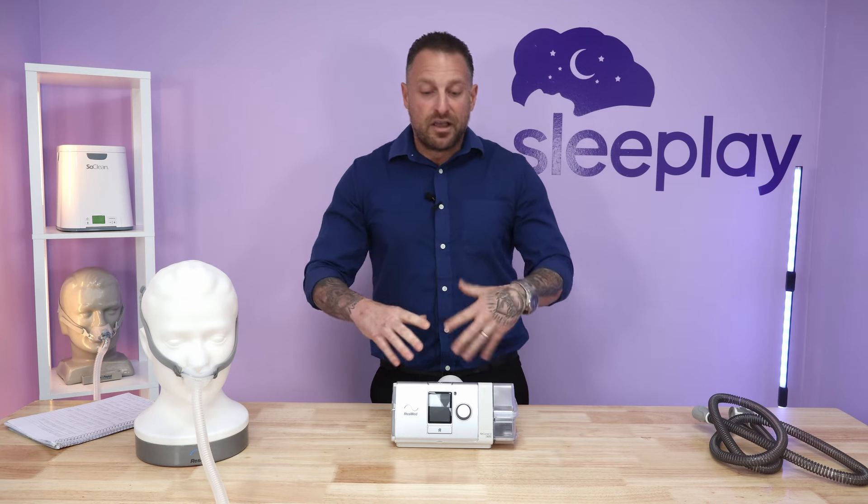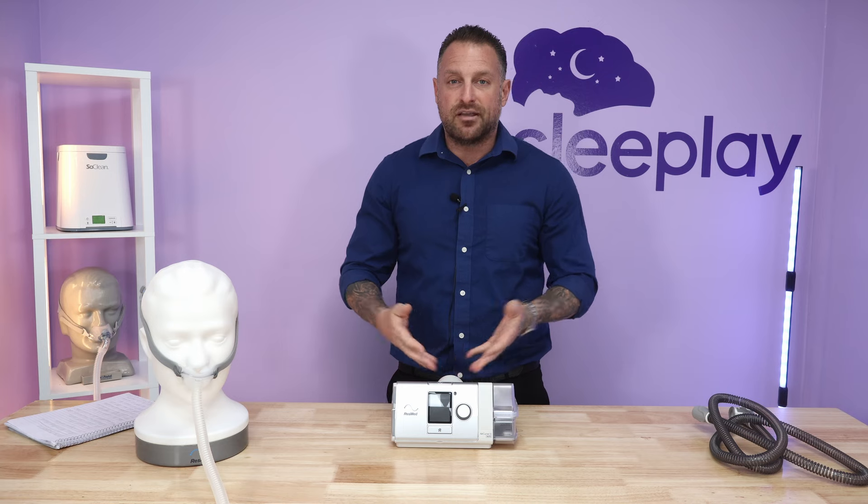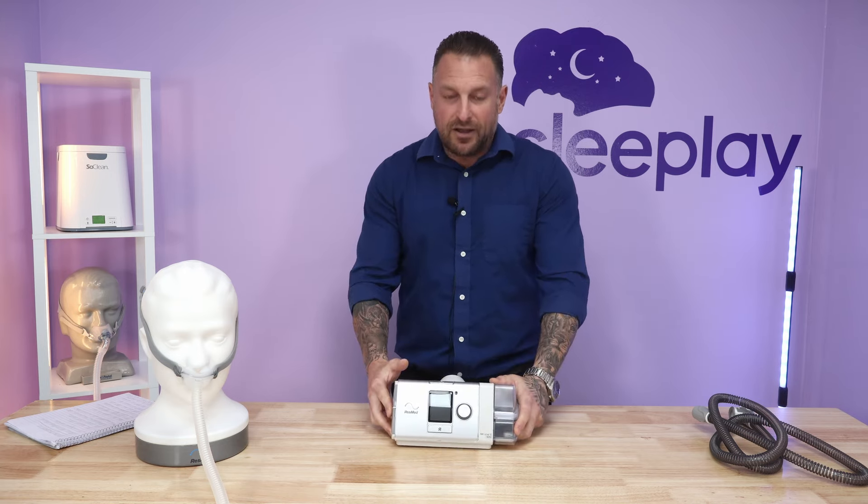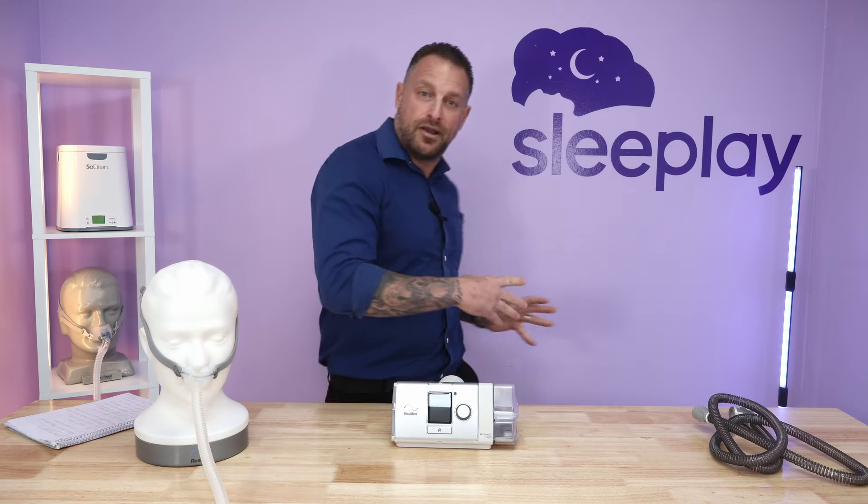To overview the outside of the machine and its general features — this is just like the AirSense 10 but in a different color, basically silver or white. It has the same screen, which I'll go over in a moment. On the left-hand side of the machine, or the right-hand side if you're facing it, you have the water chamber.